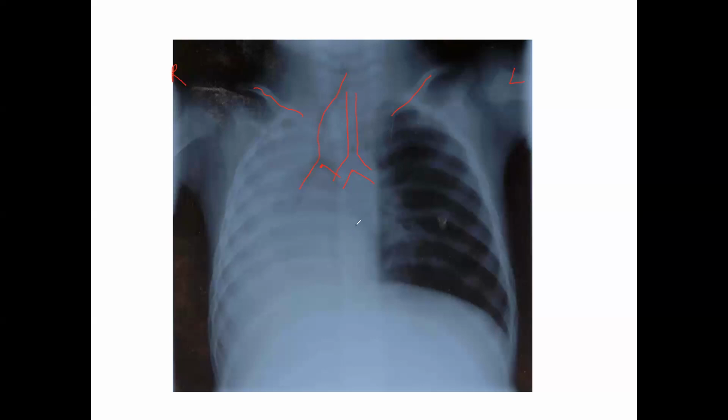Some anatomical structures that will pinpoint. So we've gone over the clavicles as well. You can see the heads of your humerus. Over here, you can see the scapula shadow. You've got to be careful. You can see that this patient's got their arms moved. So you don't want to confuse the shadow that would be formed by the scapula as any kind of pneumothorax or anything to that effect.